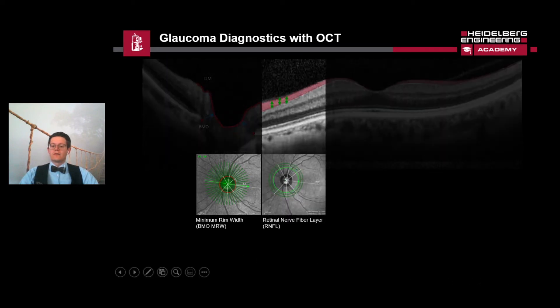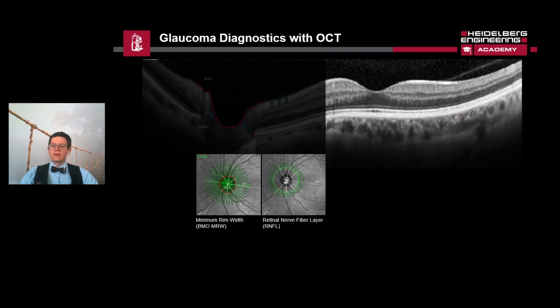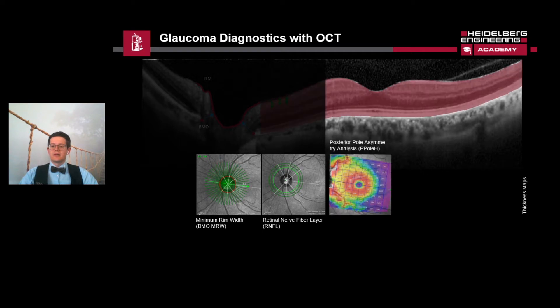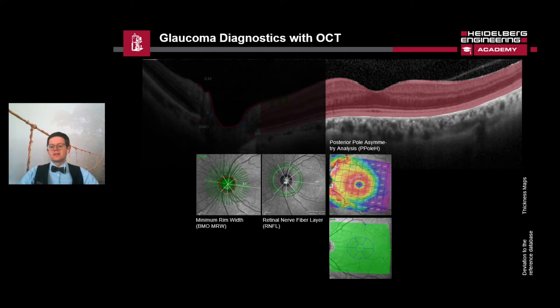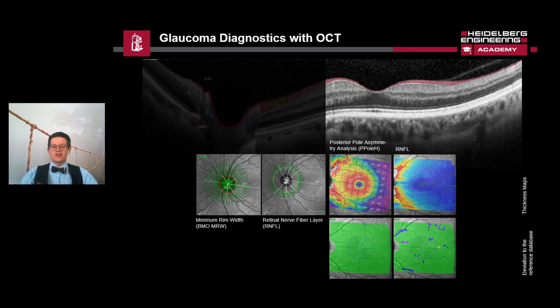A BMO-centered OCT scan of the RNFL is taken in a circular pattern, as visualized by the green circles. To calculate retinal thickness and asymmetry, a single posterior pole volume scan comprised of 61 OCT scan lines (B-scans) is taken across the macula and segmented into individual retinal layers. From these segmented layers we can get a thickness map for each individual layer, as well as a deviation map for the RNFL and the GCL.